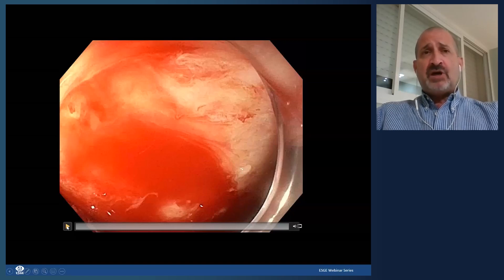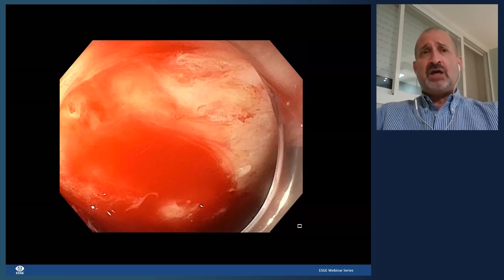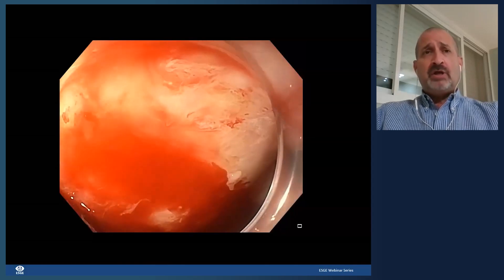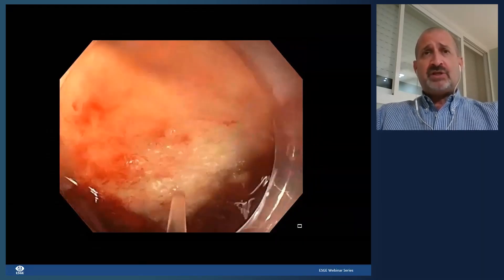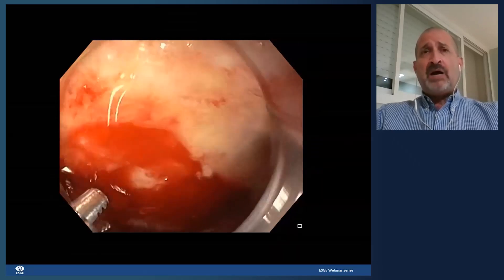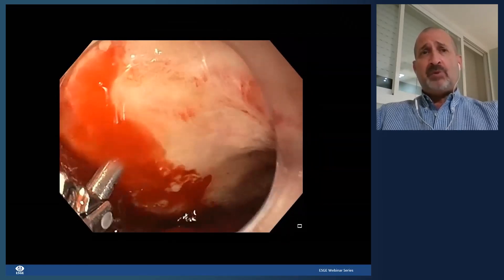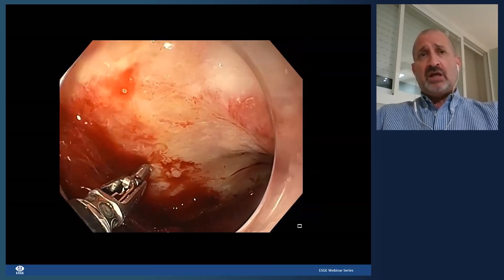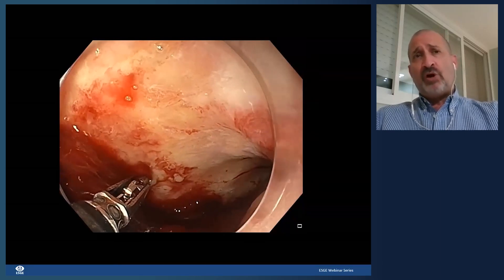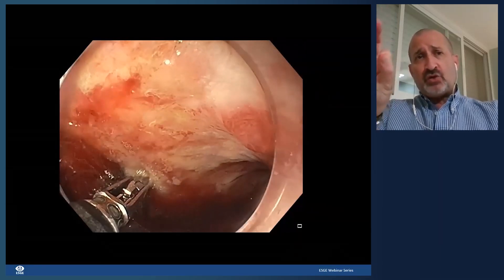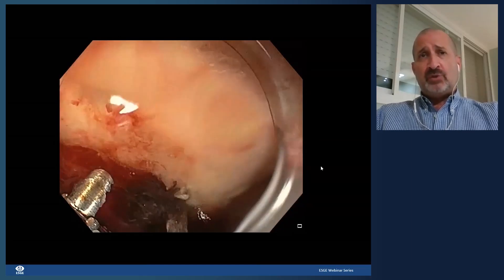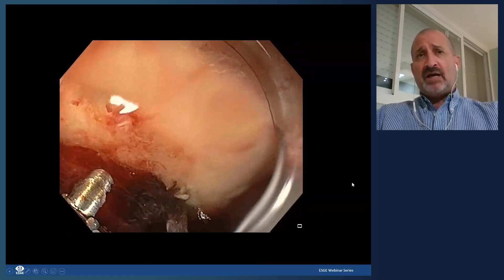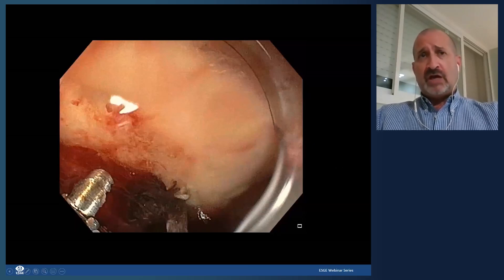Here is a hemograsper — a hemostatic forceps. These are becoming more popular in third-space endoscopy, but there are now studies examining their use in non-variceal upper GI bleeding. The actual point of bleeding is grasped, tented back slightly, and then soft coagulation is delivered — and the bleeding stops. I've rarely used this myself, but we may see it used more in treating non-variceal upper GI bleeding.